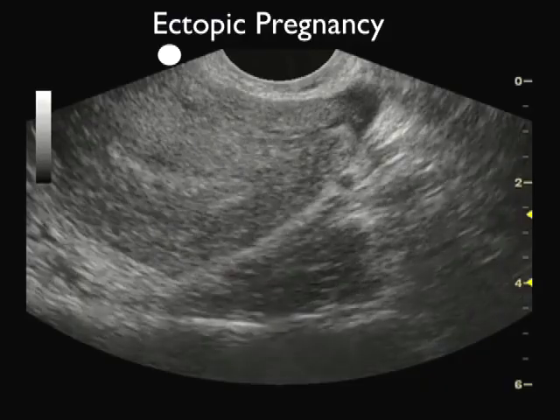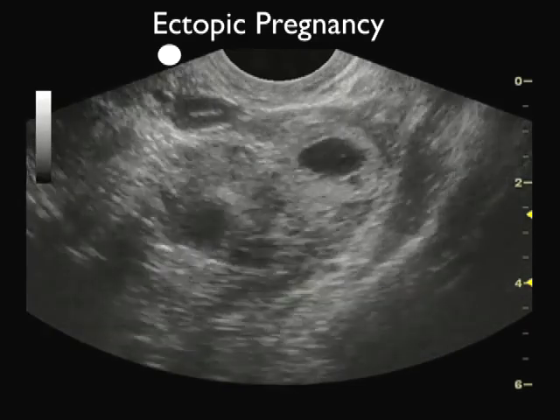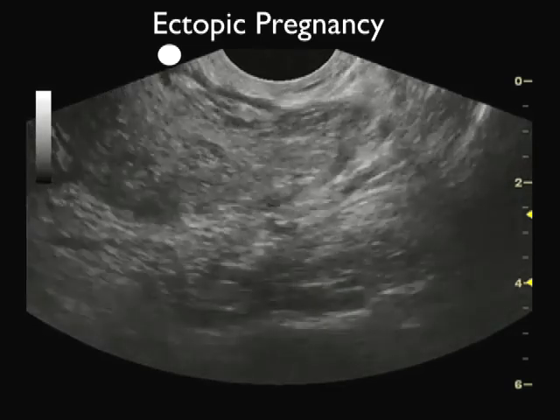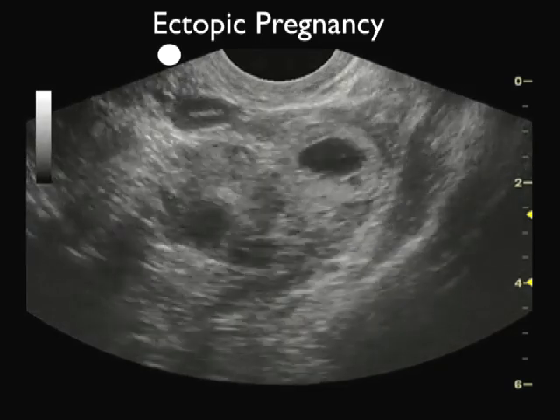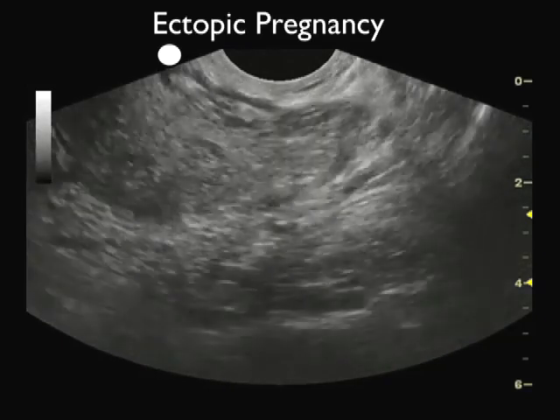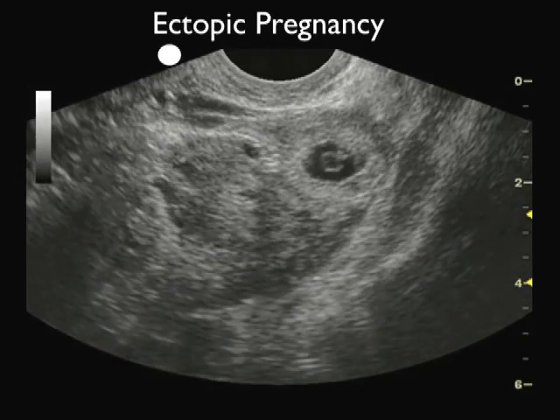Here's another version of an ectopic pregnancy. Again, we're scanning from the midline uterus, and we fail to appreciate any intrauterine pregnancy. And as we scan out towards the left adnexa, we see a positive finding right there. We see a thickened fallopian tube with contents inside. So go ahead and still down that image.